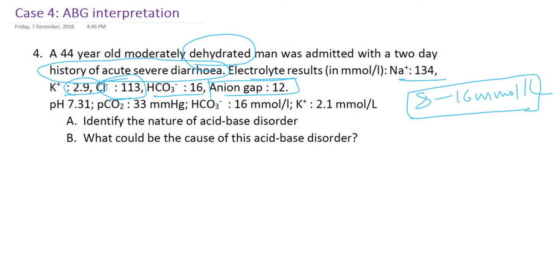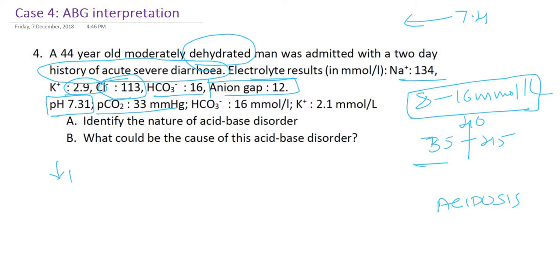First we will see pH. What is pH here? 7.31. So it is less than 7.4. So I will write acidosis. Then I will go to the next parameter, partial pressure of carbon dioxide. Normal partial pressure of carbon dioxide is 35 to 45 millimeter of mercury. For interpretation we have to keep 40 in mind. It is low PCO2. Definitely it is not a respiratory acidosis, because if acidosis has to be respiratory, there should be more PCO2. So respiratory acidosis is ruled out here.